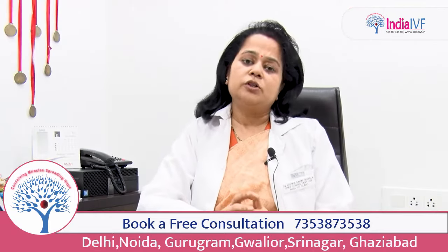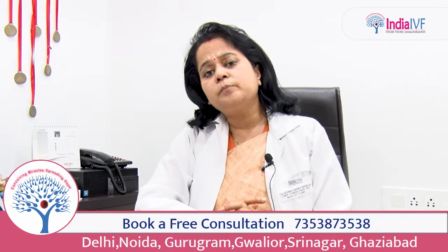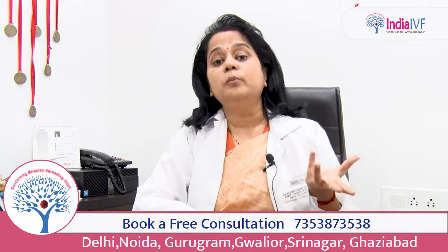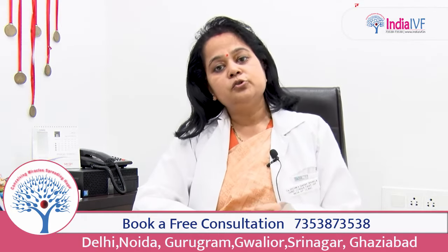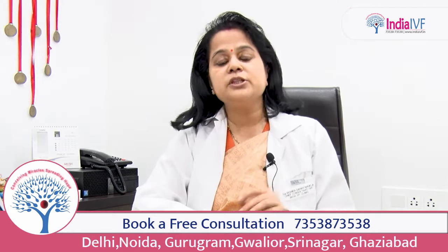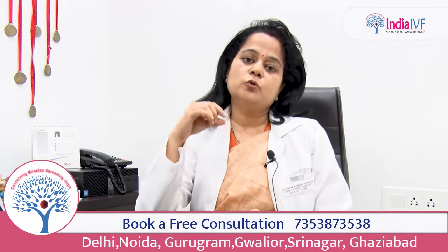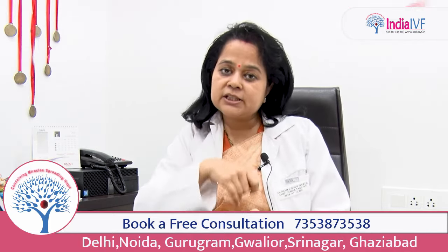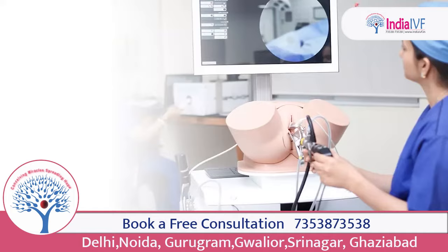So coming to what a hysteroscope is, just visualize that you have a room, and that room is the womb. And in that room, you need to see what is inside. So you put a camera in that room and you're able to see it. The hysteroscope is an elongated tube with a camera in it, and we put it inside the uterus to have a panoramic view of the uterus, so that we can increase the success rate or we can comment about your uterine cavity.